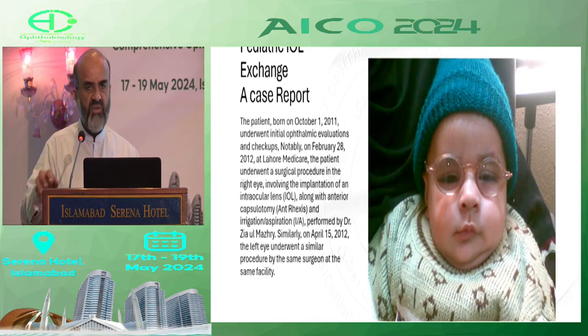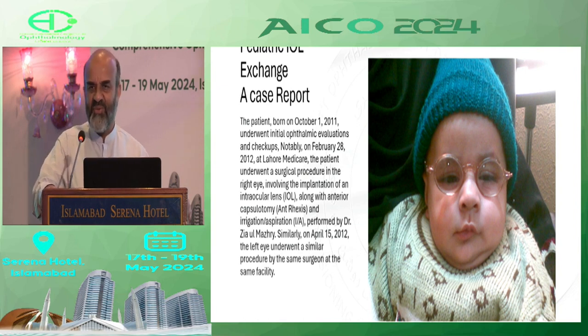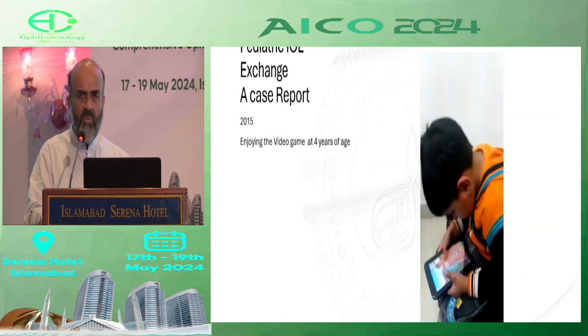And this is a child. Of course, the picture is here with consent from his mother. We implanted at about 4 months of age. And the power was about 40 plus diopters. And we implanted about 30 diopters at that age. And he was about 6 plus 6 refraction after IOL implantation.